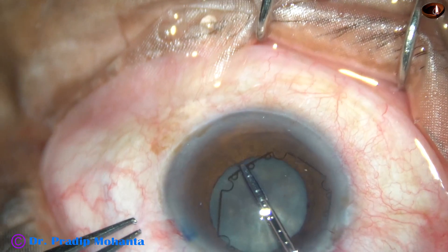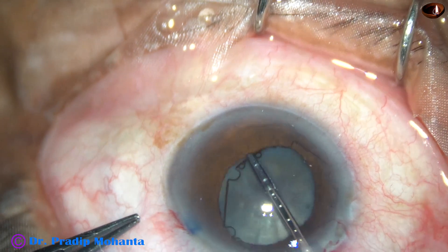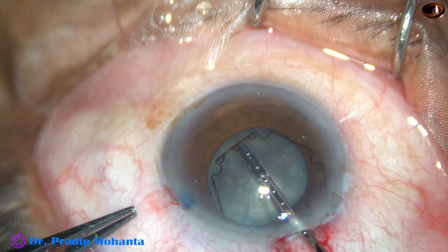It's a beautiful device, very thin. It has got notches and flanges.